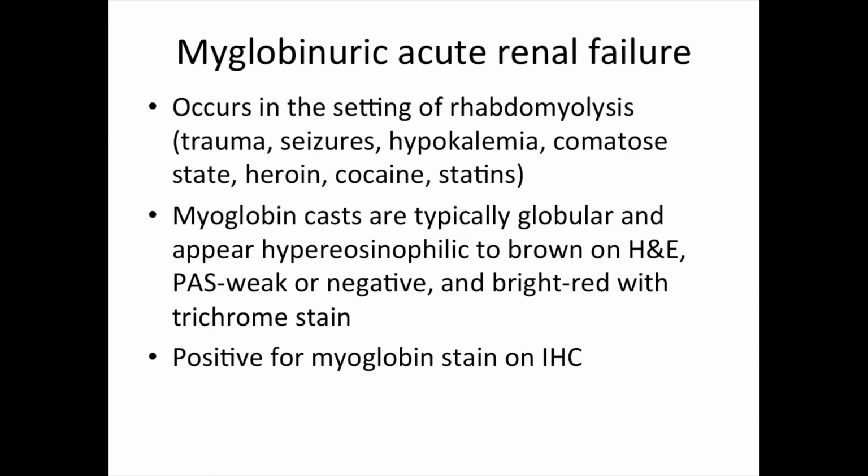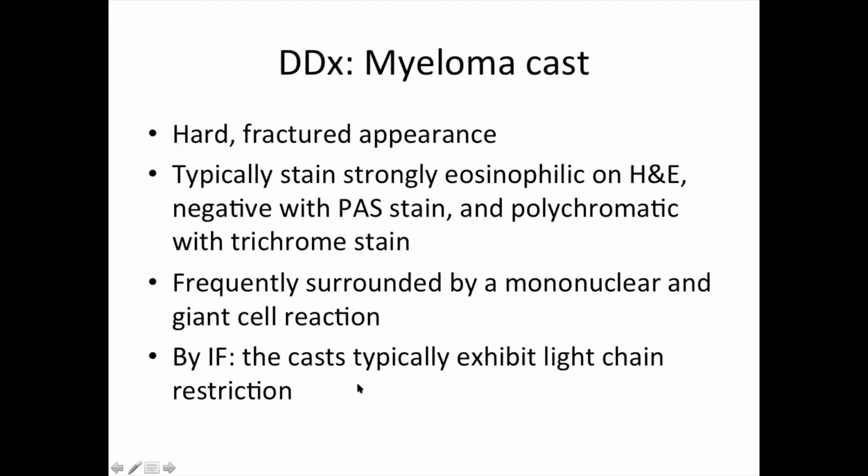زين أنا عندي مفاجأة صغنونة حقكم. We are going to compare these casts حق myeloma casts. Okay? Completely different disease, all right? But I just want you to see what a myeloma cast looks like. طبعا الميلوما cast is completely different. يعني المyoglobin, this is just a breakdown of the muscle, صح, rhabdomyolysis.